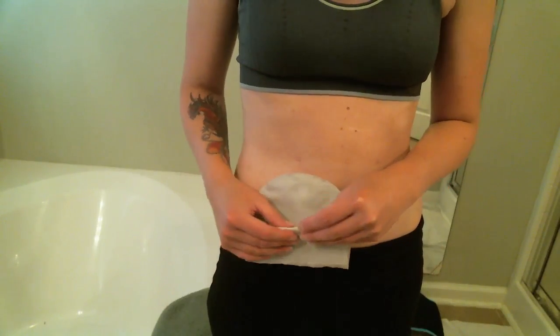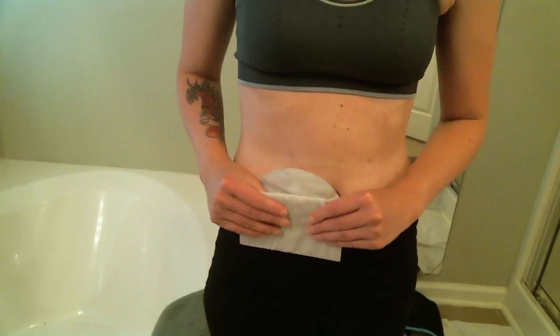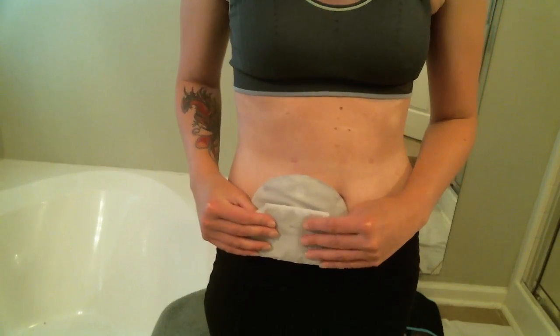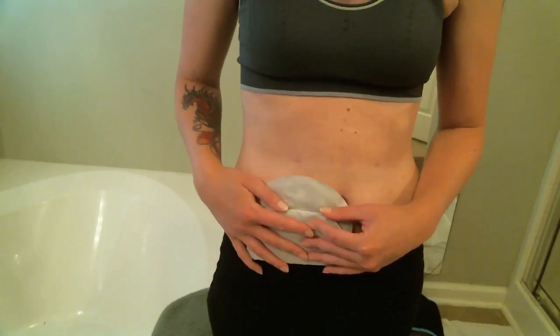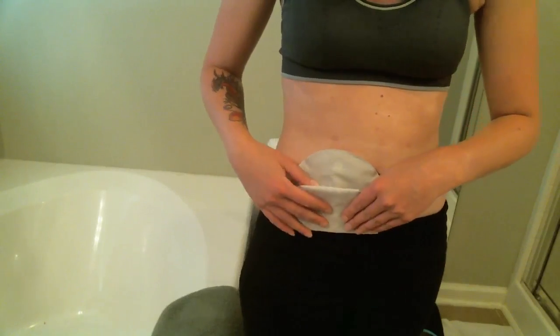I know that you may not be able to keep it like this all day, just because as it fills up it may cause issues. I did not try that today, but I might try it in the future just to see how it holds up once the bag starts filling up itself. But it's great for things like that if you need to keep it out of the way, or just need a smaller bag for whatever reason.